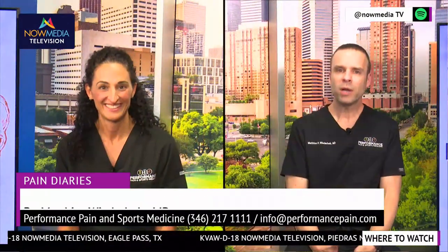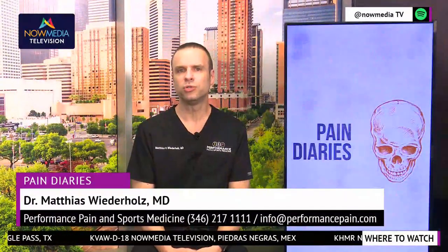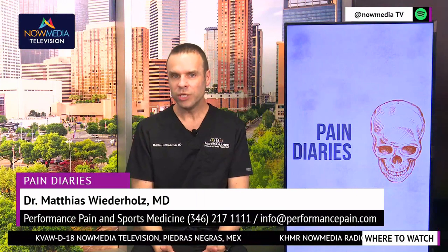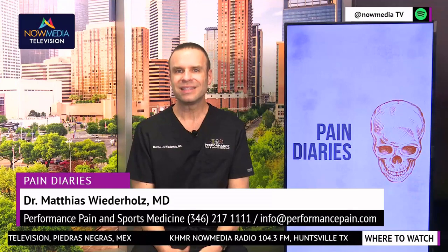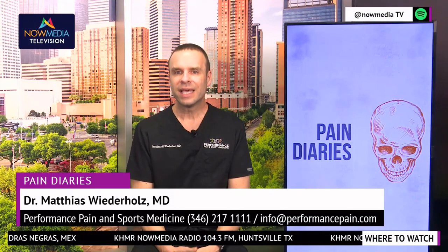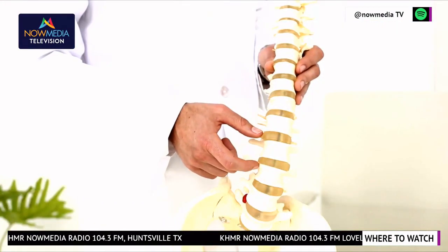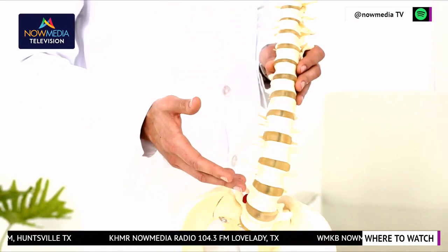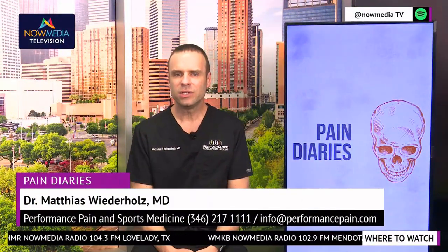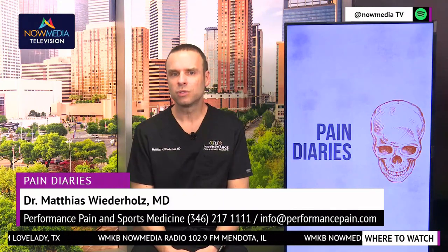Sure. Yeah, so spinal cord stimulation is fully reversible. There are 2 types of implant procedures that can be done. One is what we do, which is called a percutaneous electrode array. This is basically implanting electrodes that can go in through a needle. And so those can be removed very easily. The other is a paddle type of electrode array. This is put in by a spine surgeon, and it is done through removing some bone in the spine so that that paddle can be accommodated. That one is much more difficult to remove.